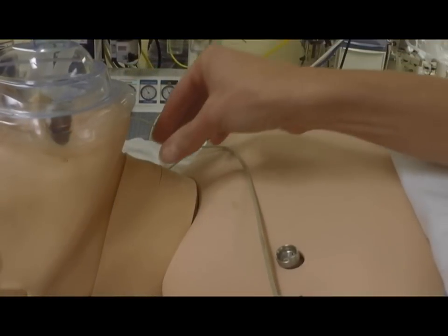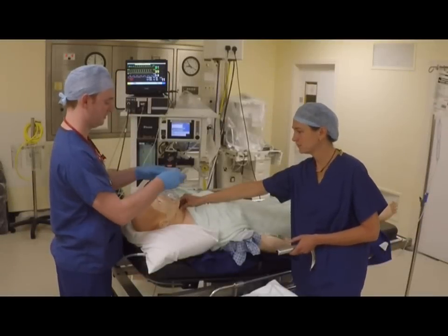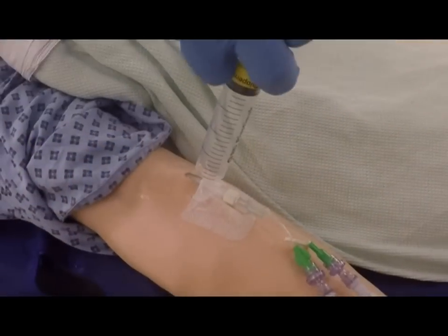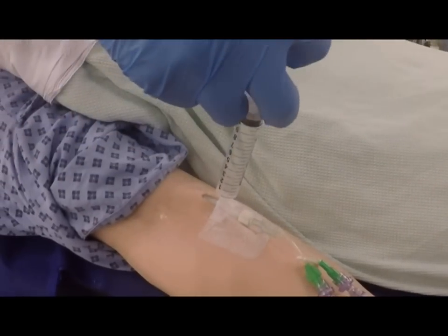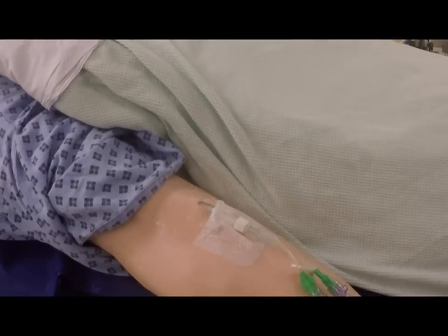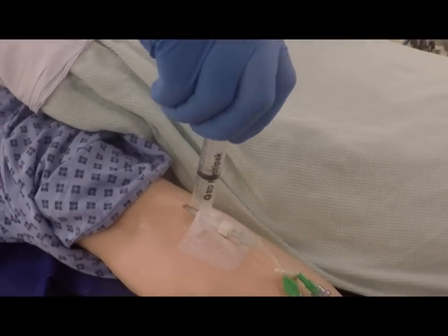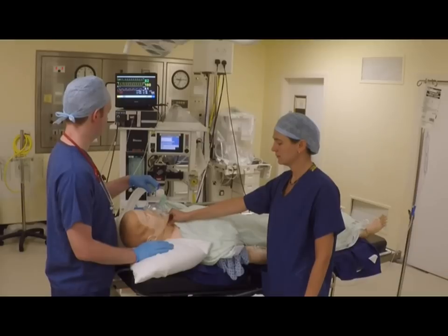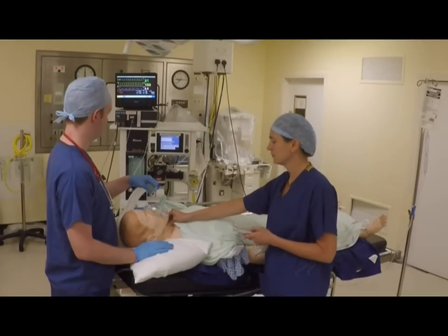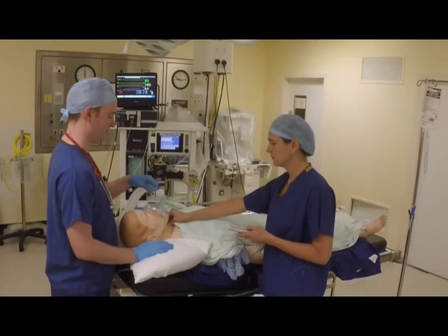Cricoid pressure can then be applied at a pressure of 10 newtons and induction commenced. This involves the administration of a pre-calculated dose of induction drug with a flush of saline and the immediate administration of a paralyzing agent. If using suxamethonium, fasciculations will be evident as its action commences. If not, a period of 45 to 60 seconds is required before intubation can be carried out.